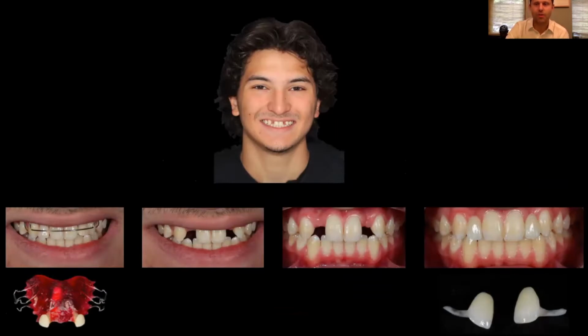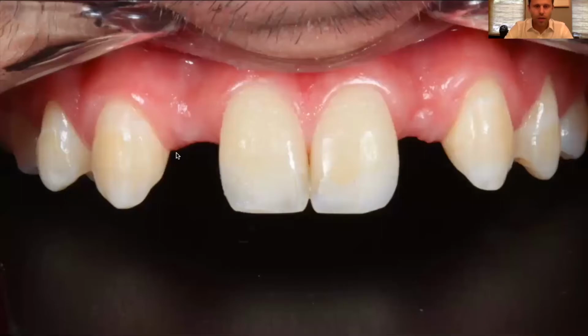So we take an X-ray of the wrist. We make sure that everything is fused, the growth plates have fused, and there is no more growth for him. So then I'm comfortable placing the implants at that point. So this case, I'm going to walk you through. This is going to be the surgery. You're going to watch how we do the incisions, the implant placements, and then I'll show the bone graft.